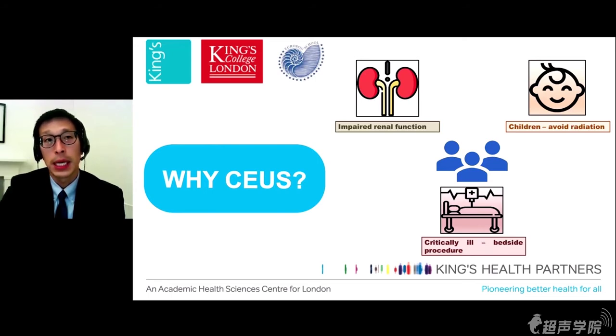These groups may involve patients with impaired renal function, where nephrotoxic contrast agent is undesirable, or it may involve children where radiation should be avoided, or it may involve critically ill patients where we would like to perform these procedures at the patient's bedside without moving the patient from one part of the hospital to another.